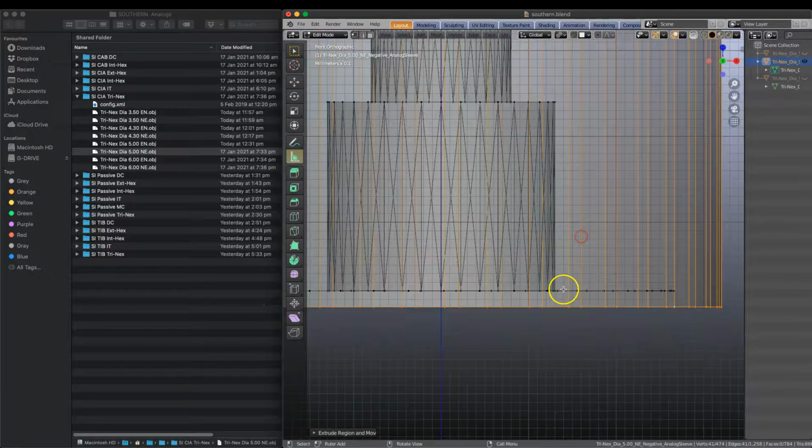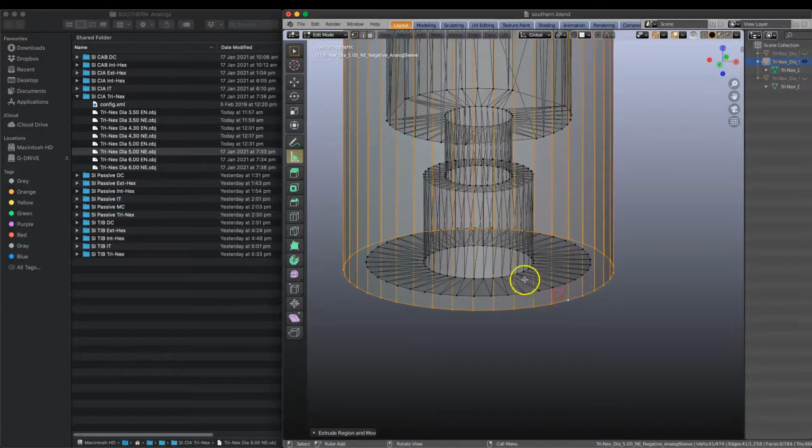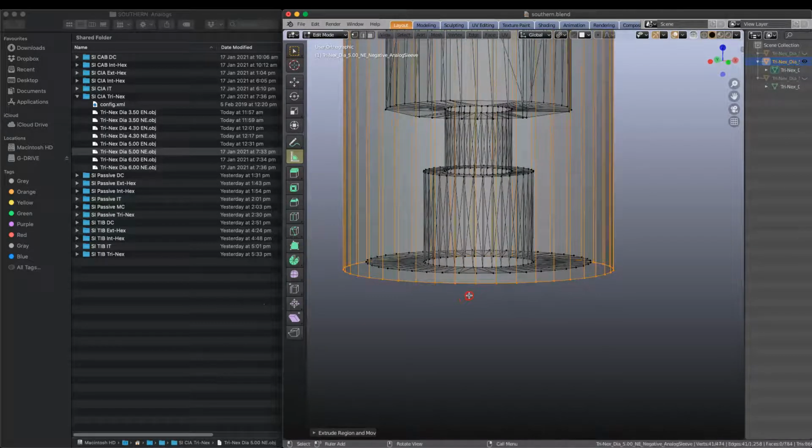We're going to zoom in again. So what we want to do here is, instead, we want to keep the plateau, but we want to create a little thin small ledge. So remember, this component will be designed to be extruded through the dental model, both on the upper side of the dental model and the lower side. If you've got IPD implants, they have a screw entering laterally across to fasten the analog, so we want to make sure these will create perfect cutting tools for us.